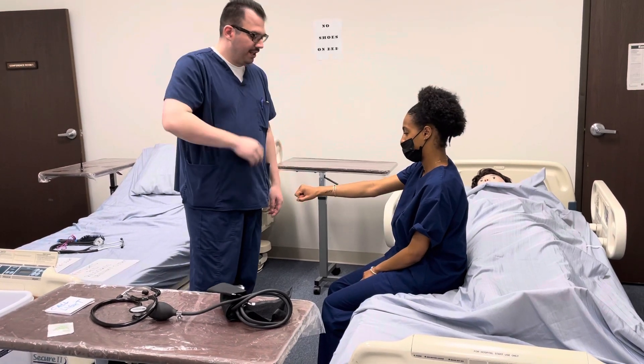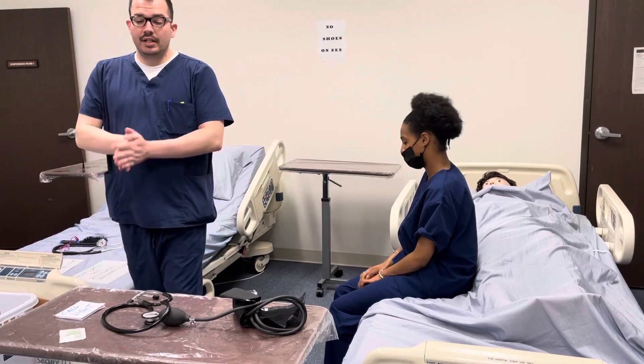Can I check your wristband to confirm that it is you? Thank you. I'm going to go ahead and provide privacy and wash my hands.